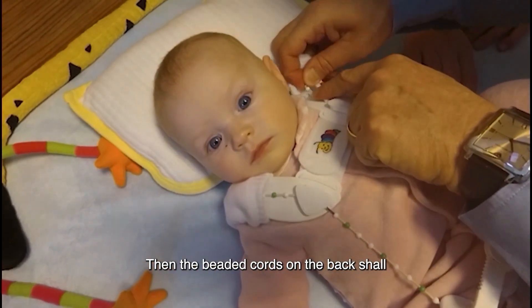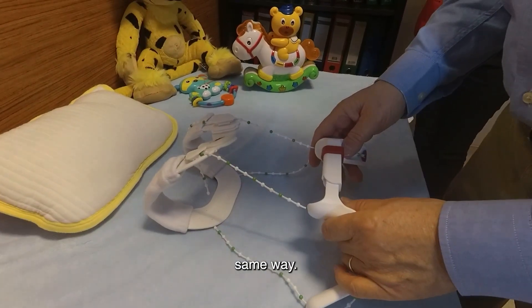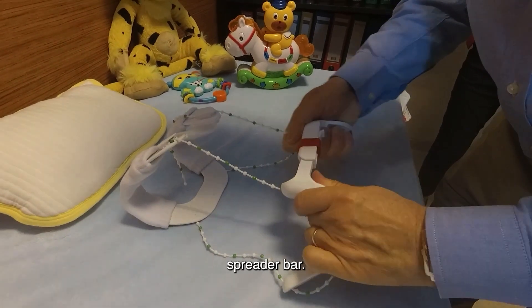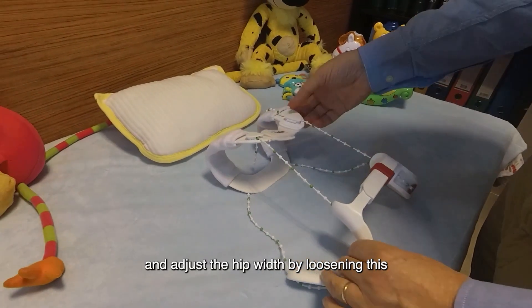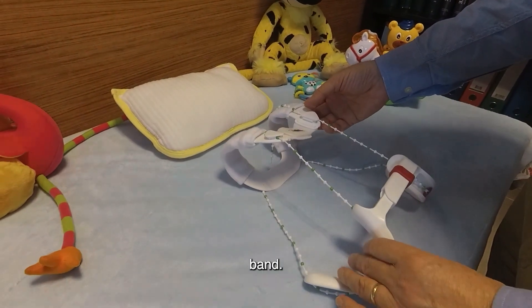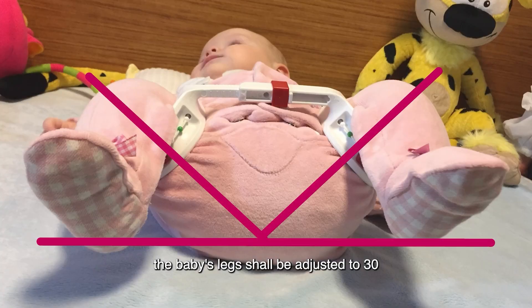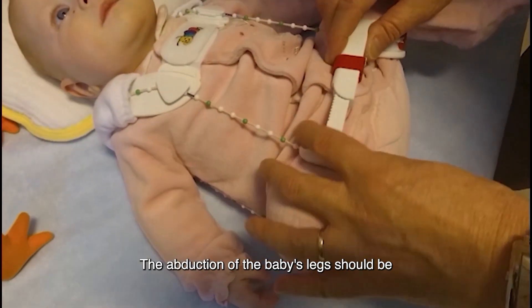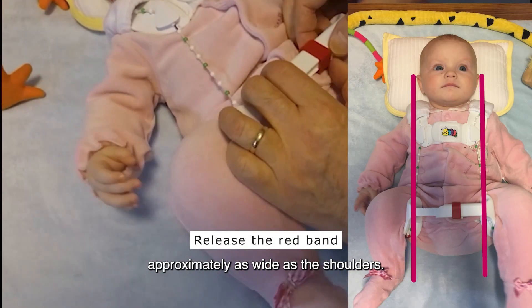Then the beaded cords on the back shall be adjusted by moving the beads the same way. There is a red adjustment element on the spreader bar. It is possible to move the spreader bar and adjust the hip width by loosening this red band. Therefore, the baby's legs shall be adjusted to a 30 to 45 degree angle of abduction.